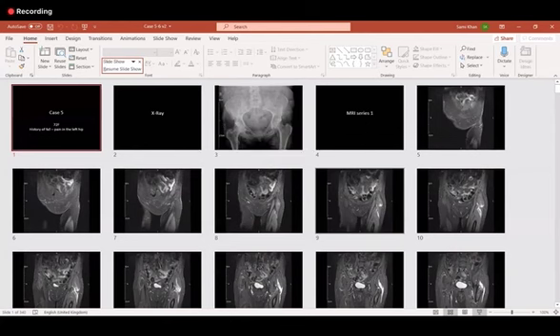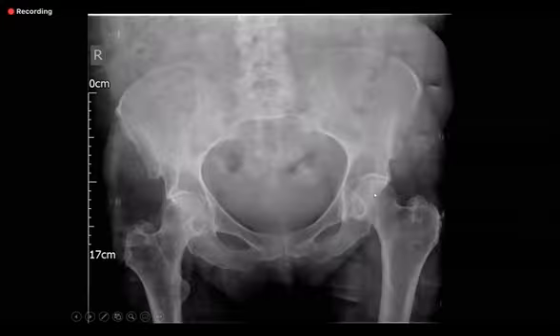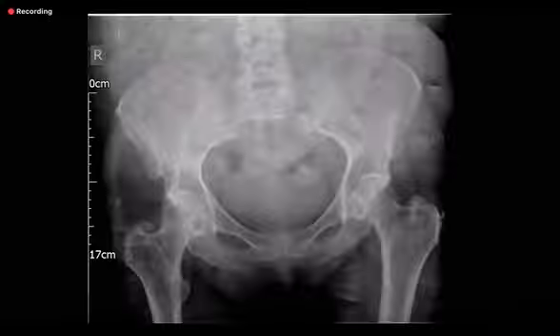Can you see? Yep. Okay. Yep. So let me give you. Have you taken over the mouse? Yeah, just stop here, please. Okay. Go to the X-ray. Go back. Okay, Yep. Now this is, please begin.